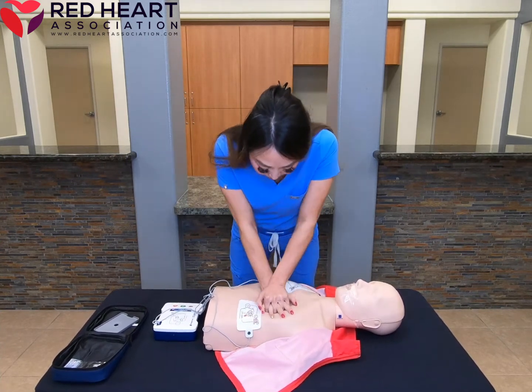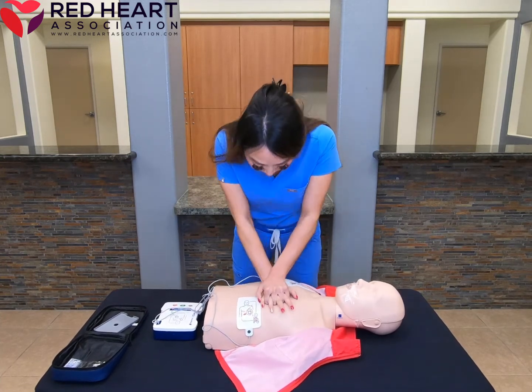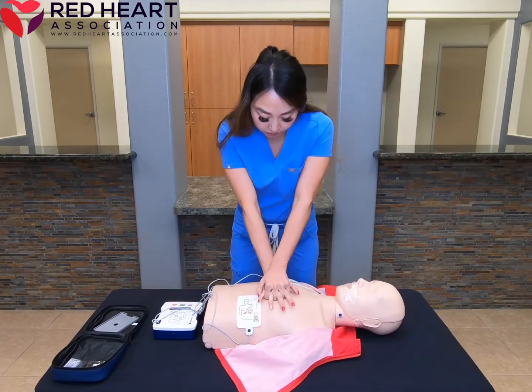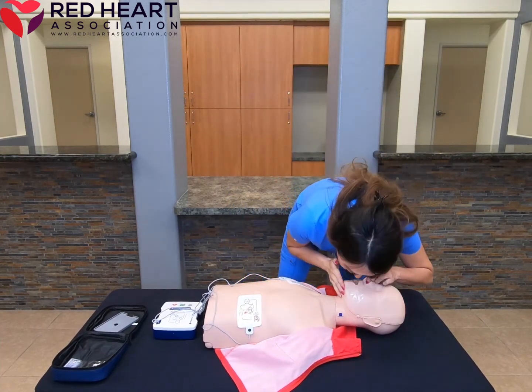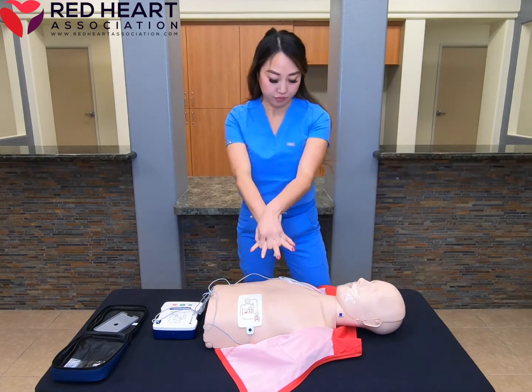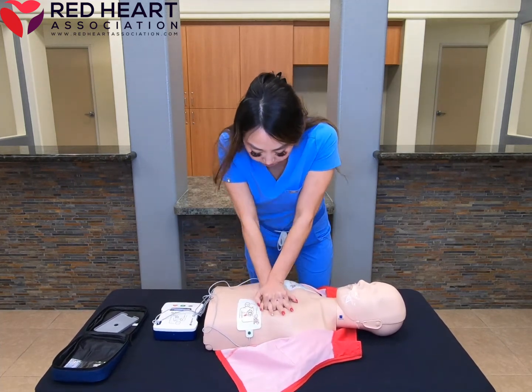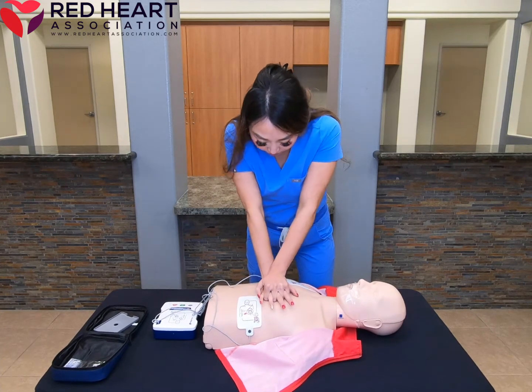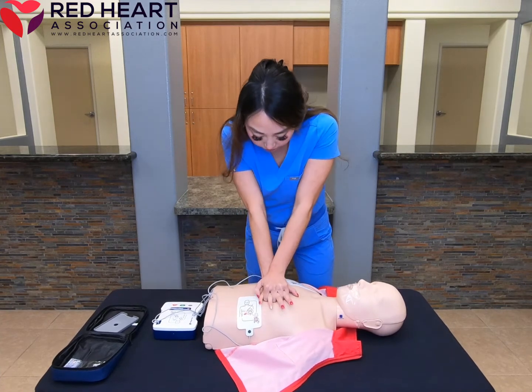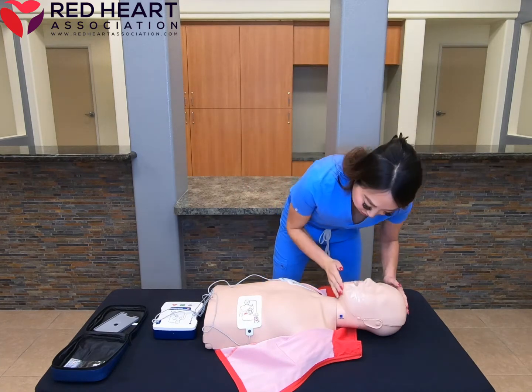Ten. 20. 30. Give 2 breaths. 10. 20. 30. Give 2 breaths.